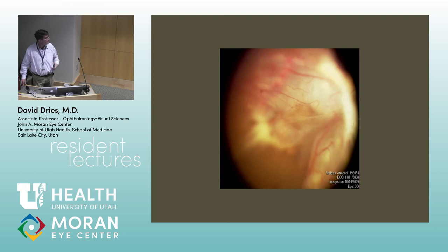So this is another one. Well, let me tell you the whole story because it taught me something. So this kid, could this be retinoblastoma? Look at this elevated area, and these vessels don't look dilated. But you don't want to miss a cancer, right? So it's kind of uncertain. And what else could this be?